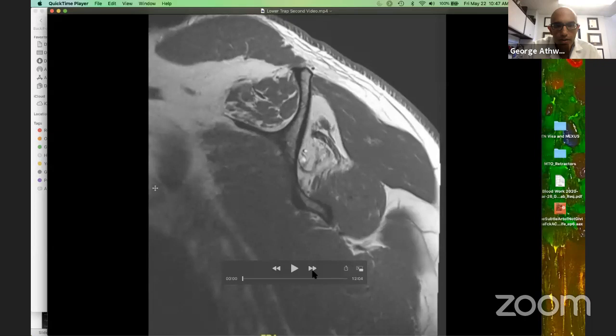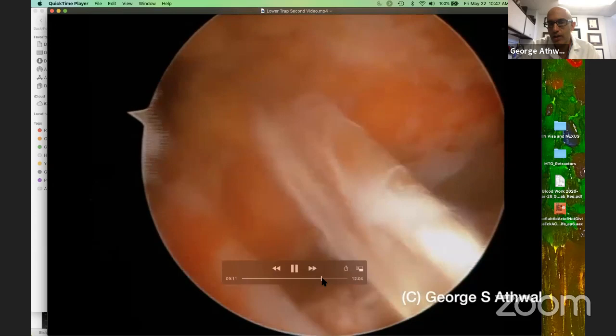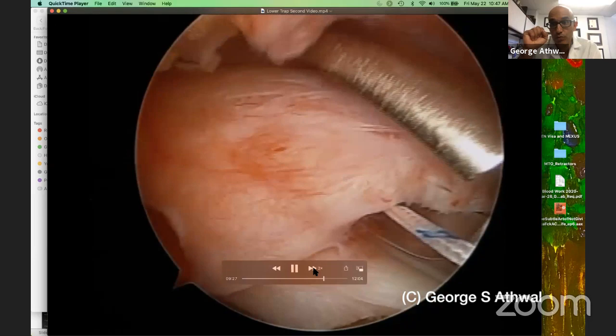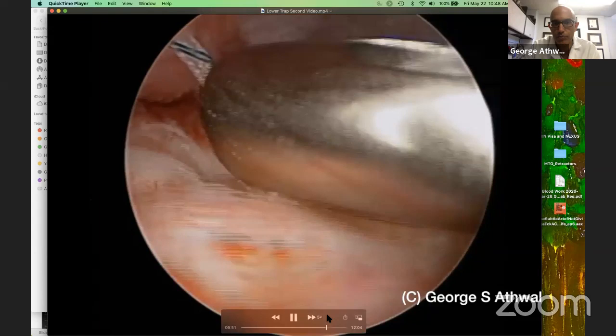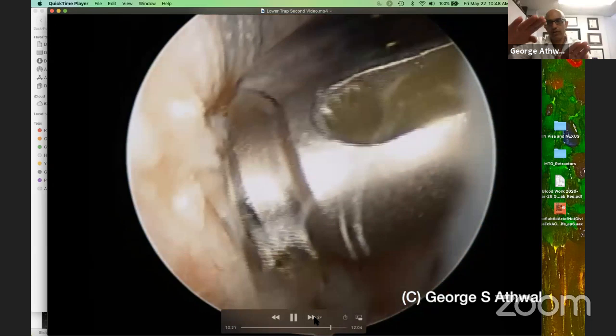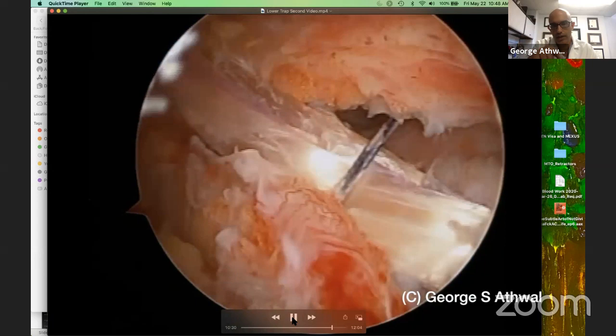Yeah, so in this video here, you'll see that I'll do the full repair. So in this case here, I'll keep on going. Now I'm grabbing the superior cuff and I'll try to sew it over to get as much coverage as possible. So here I'm going to do a double row repair. If you remember in this case, on the MRI, he had grade 2 fat infiltration within the supra, but the infra was grade 4. So I could fix his supra in this case. I'll speed up so you can see what I'm doing, fixing the supra, double row supra repair. And then once I fix the supra, I decided, well, maybe I'll do a side to side to cover the graft up too. So here I'm doing a side to side. There's the graft. I'll pause that. So here's the graft. Here's my supra repair. Then I did a side to side repair of the teres minor to my supraspinatus. So I try to cover it, but if I can't, I leave it.